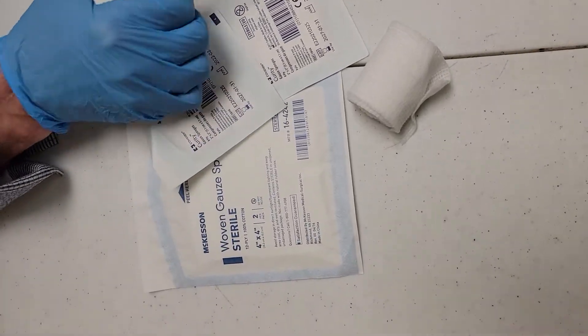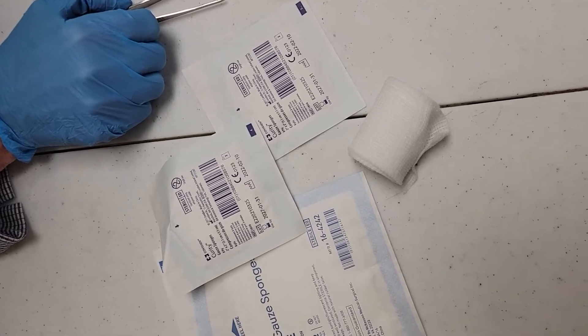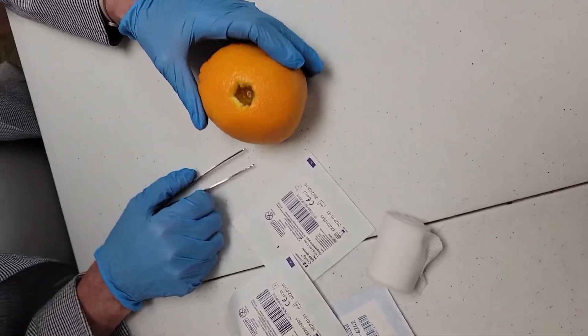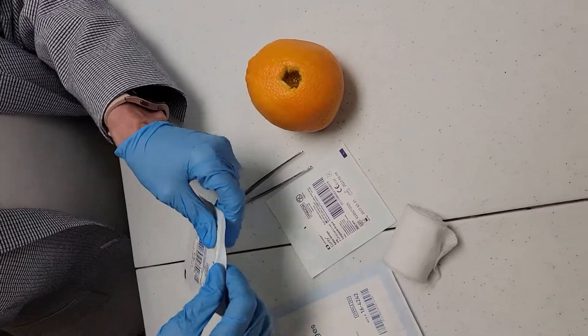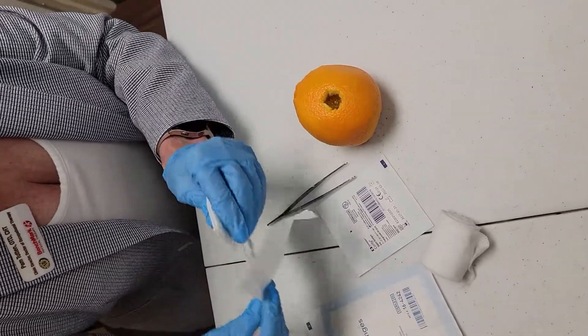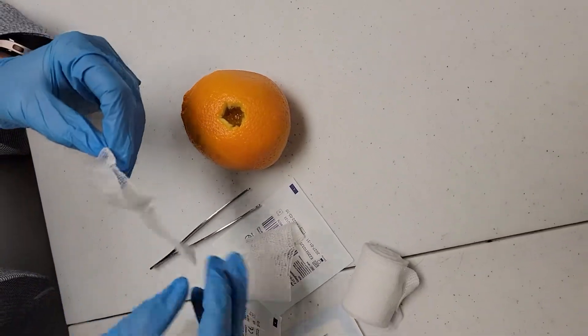All right, ready. So we have the sterile gauze sponges and then the rolled gauze and there's our wound. So packing's easier than you think. This is a little bigger wound and we're going to see in the hand.